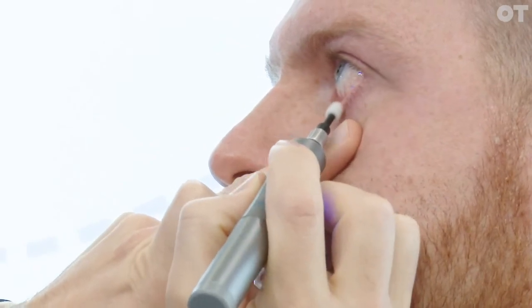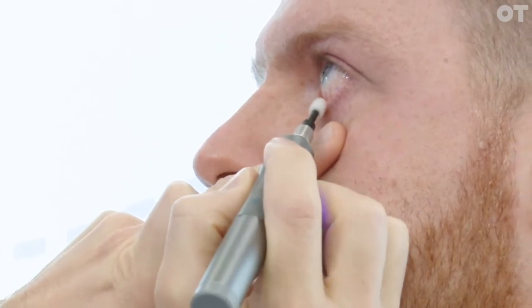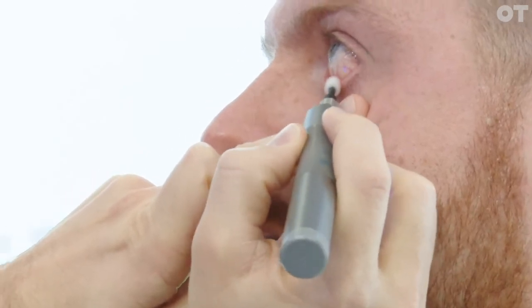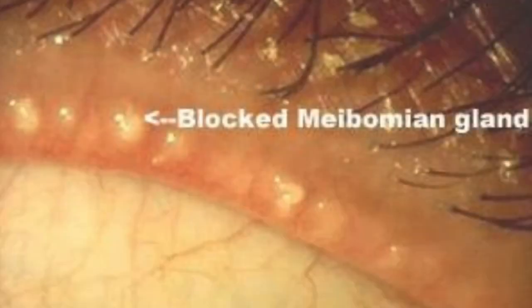The benefits of this procedure are two. It decreases the bacterial load, the bacterial biofilm on the eye, which decreases the chance of an infection. It also removes the bacterial biofilm that is clogging the eyelids to protect your natural oil glands over time. We want to ensure that your oil glands are healthy and functioning for the course of your lifetime. You only get one set of oil glands, and we want to keep them healthy.